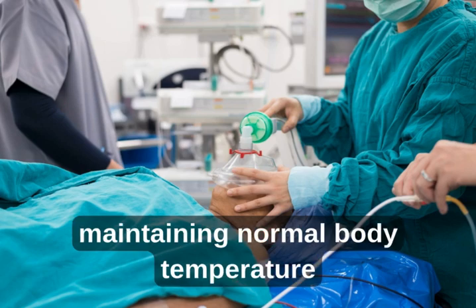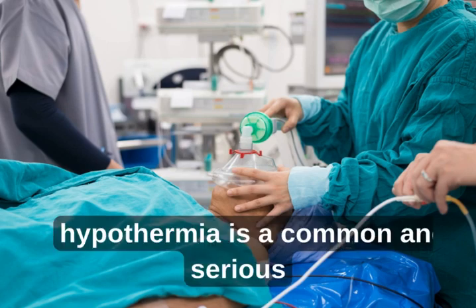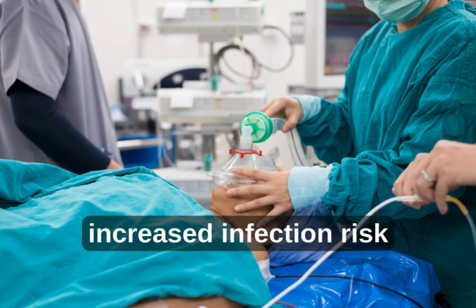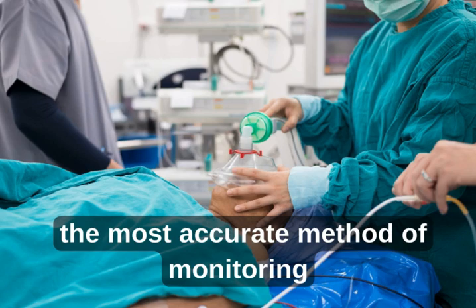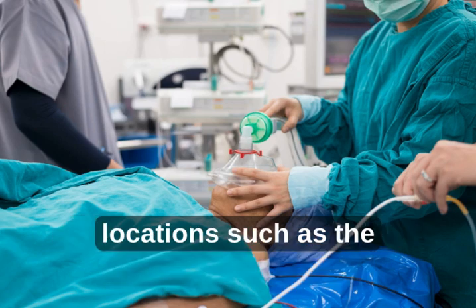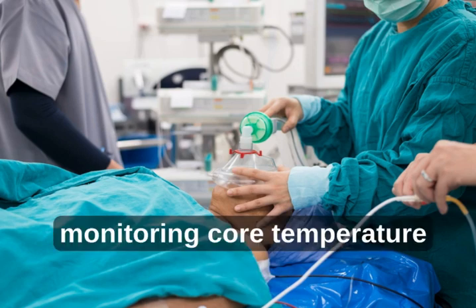4. Temperature monitoring. Maintaining normal body temperature is a vital component of perioperative care. Hypothermia is a common and serious complication of anesthesia, leading to issues such as coagulopathy, increased infection risk, and delayed drug metabolism. The most accurate method of monitoring core body temperature is through a temperature probe, which can be placed in various locations, such as the esophagus, nasopharynx, or bladder.